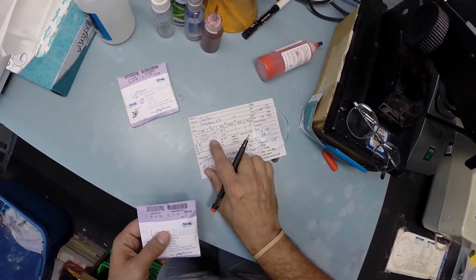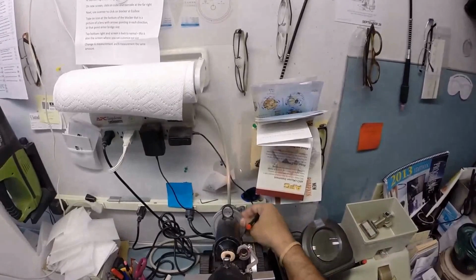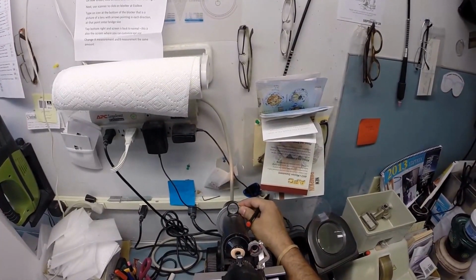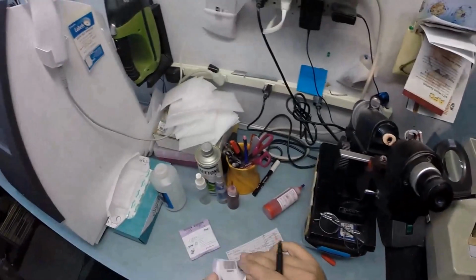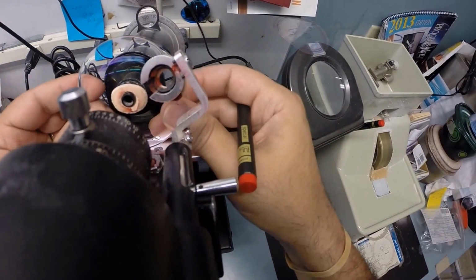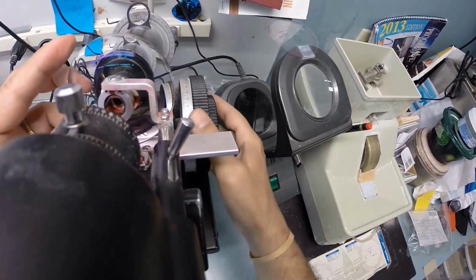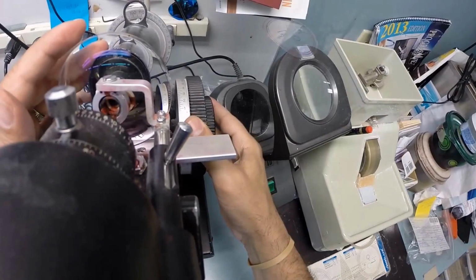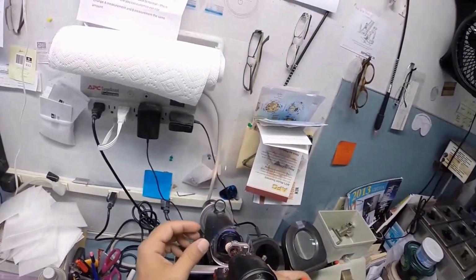It's -4 1/4, -1 1/4 at 106. Take the lens out of the protective sleeve, put that on there, rotate the lens. Well, actually I got to put it on 4 1/4, the power drum. Rotate until the sphere power comes in clearly. Find the optical center of your lens that you'll be looking through. Check your astigmatism correction. And put 3 dots on there.